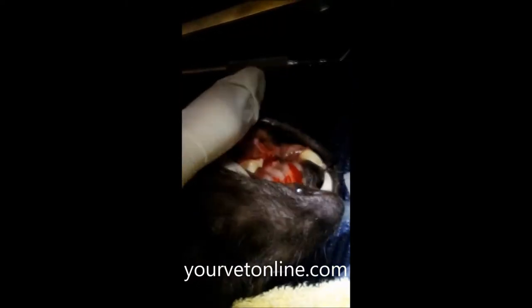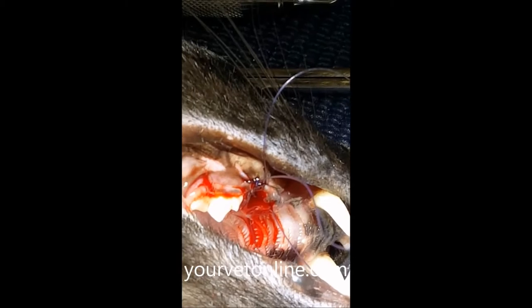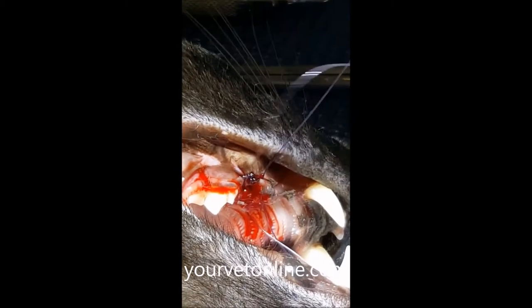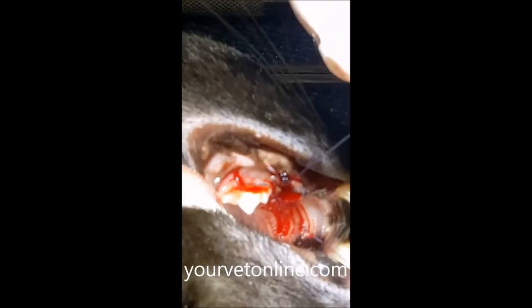Now there's a bit of a hole that's left over when we remove a tooth. Not all teeth require suturing, but this one's a decent sort of hole that could actually mean food gets trapped in here. So we're going to use absorbable suture to suture this area up.